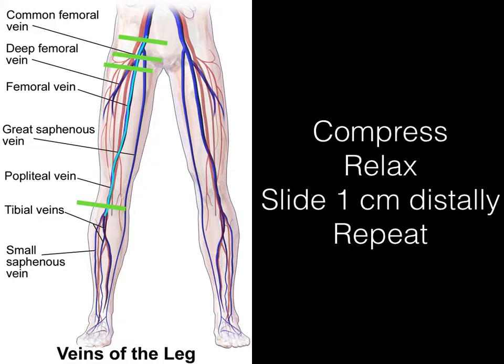Now, I wanted to make a diagram to show what the orientation is going to look like on our screen. I know in this image here I have a right leg, but for this next diagram I'm going to move to the left, and we're going to move back and forth from right to left from time to time.